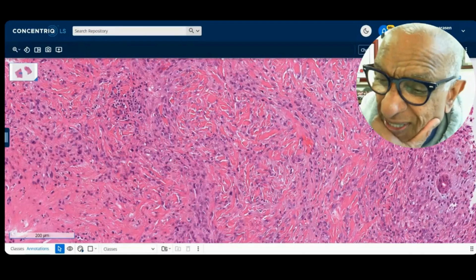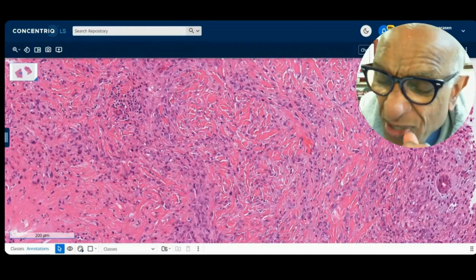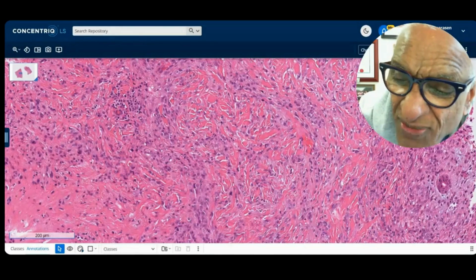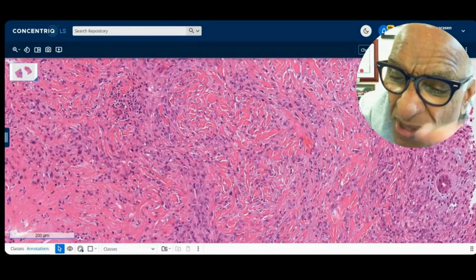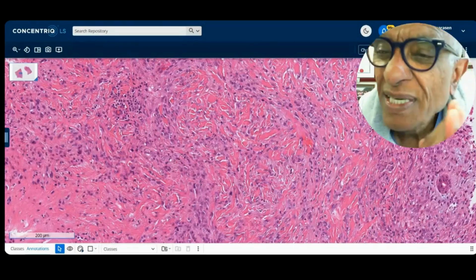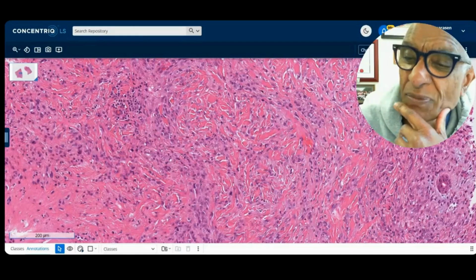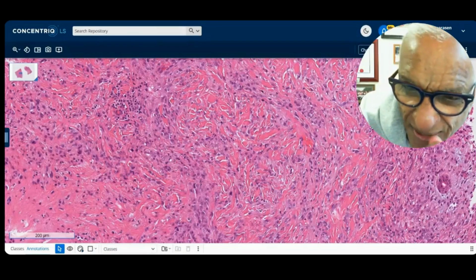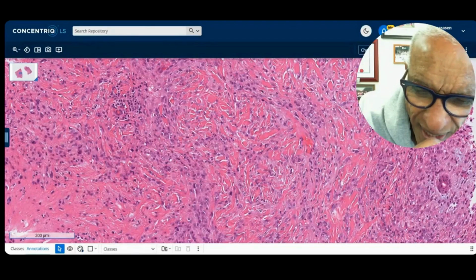Does the patient have a history of HIV? Omar, what do you think of Kaposi sarcoma? We'll give you the HHV-8. It is negative. Albert Tool, rhabdomyosarcoma. You mentioned earlier, Albert Tool, are these cells rhabdoid? So let's come back to that. You've got CD34 positive. Okay.